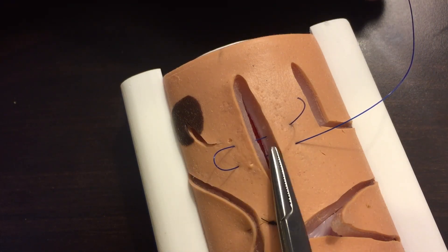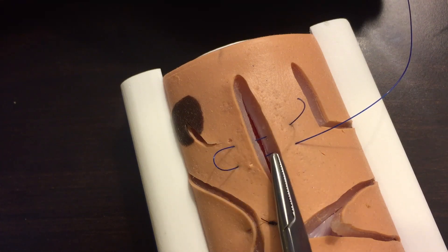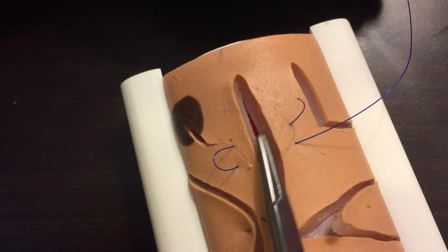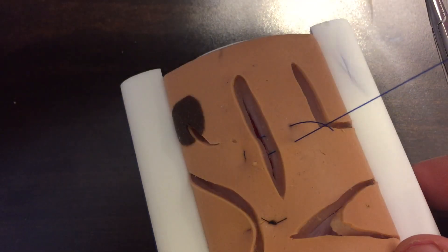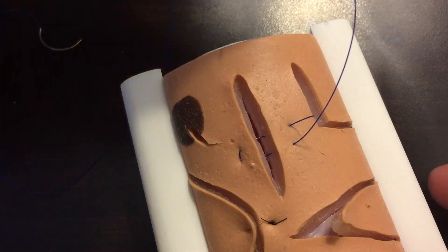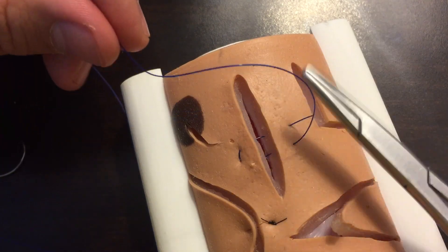We pull this through. See how our suture passed through the skin? We entered, exited, came down a little bit on the laceration, entered and exited, all the same depth, all the same distance from the entrance to the skin edge.